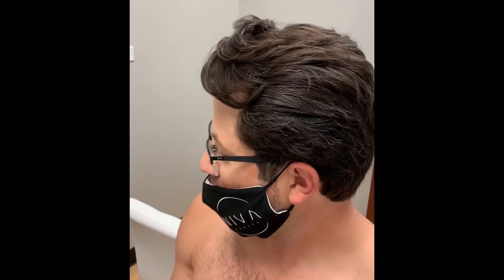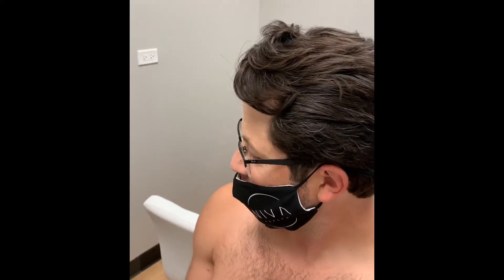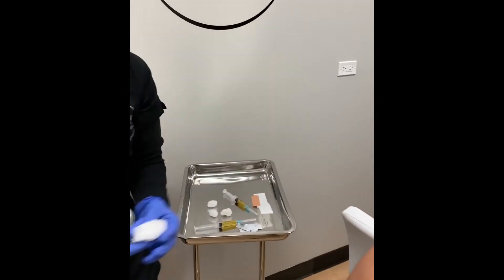One is the concentrate — the concentrated, platelet-rich plasma — and the other one is the platelet-poor plasma. We're going to put the platelet-rich plasma closer to the area of chief complaint, and then put the platelet-poor plasma around the area. We're actually going to pepper the area with all these regenerative growth factors.